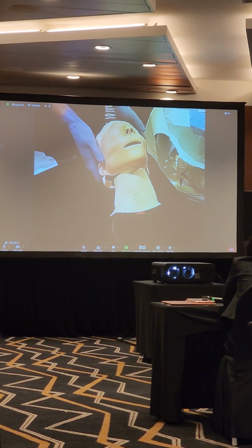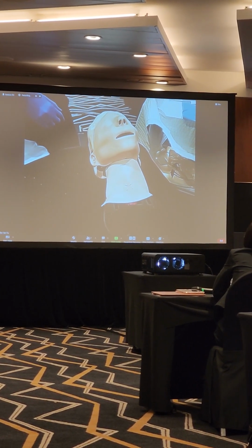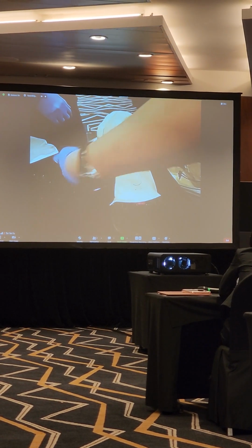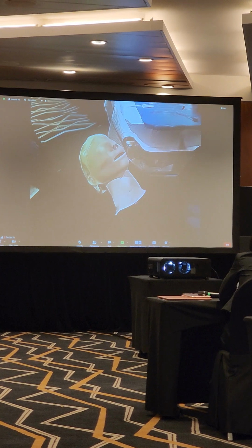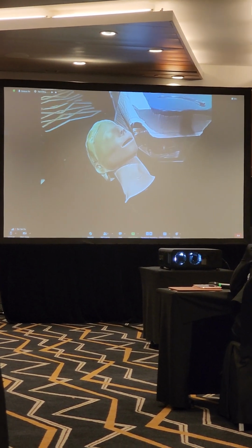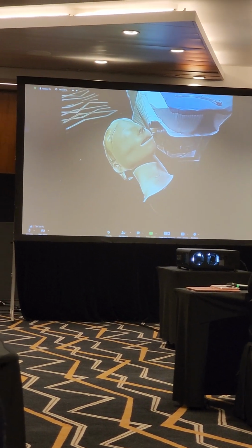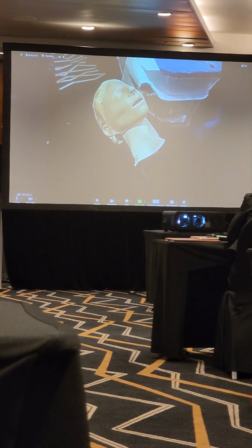For practical purposes, if you could put a shoulder roll, that would be even better for surgical cricothyroidotomy. But if that's not available, what I find useful is to shove the pillow, which you usually place under the patient's head, under the patient's shoulders so that the head is left hanging out, and you achieve hyperextension very readily and easily. Otherwise, if there's any cervical trauma, we try to avoid that as far as possible. You can still attempt to do the procedure.